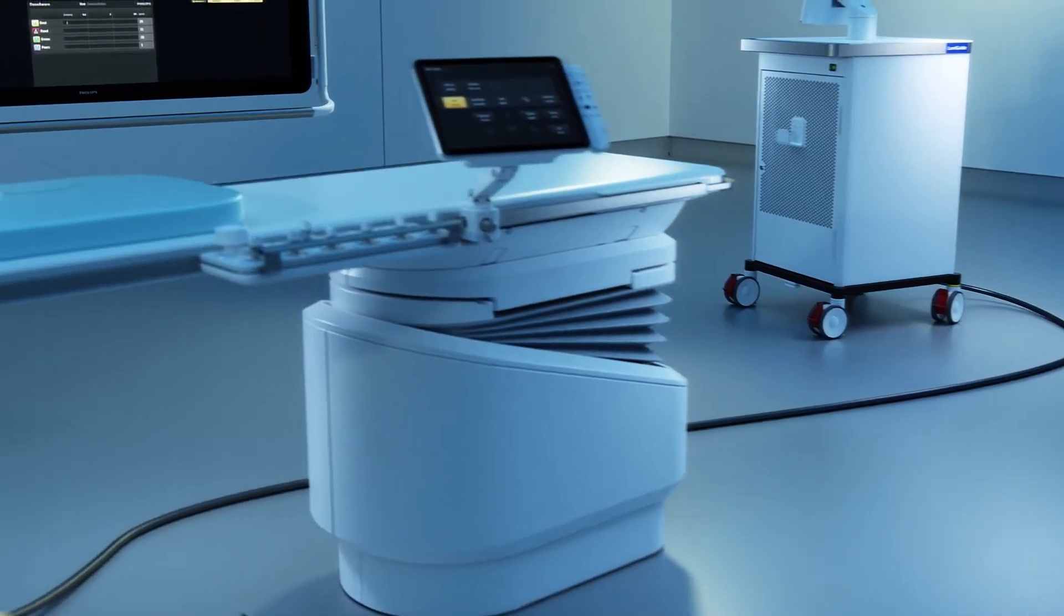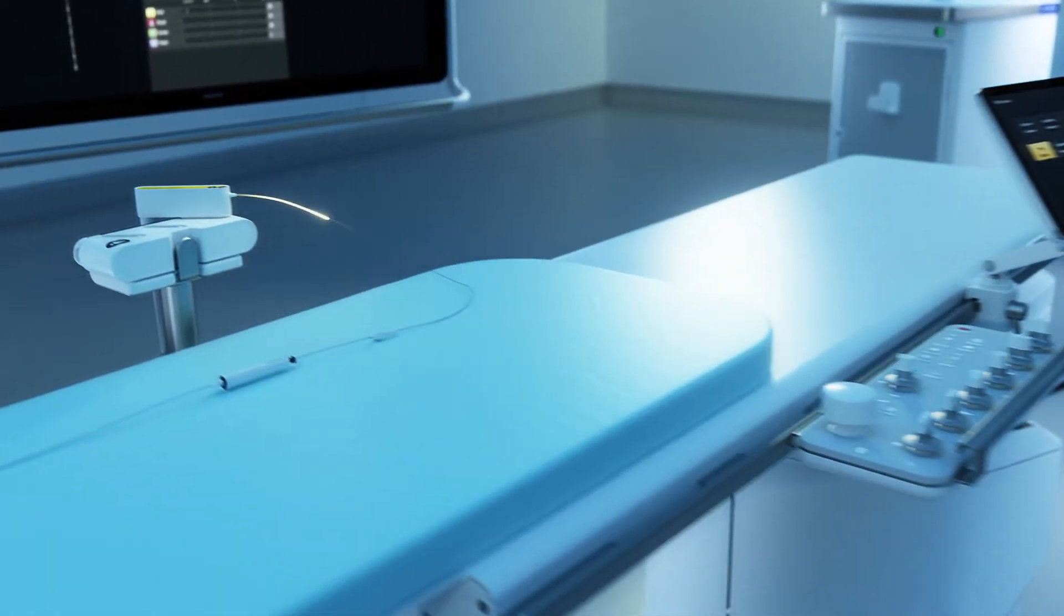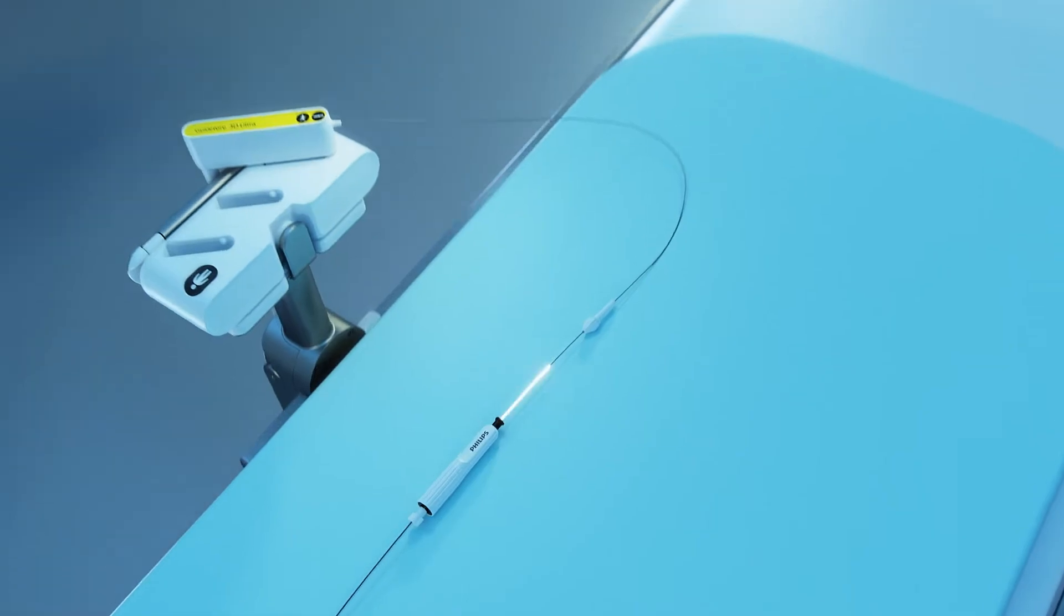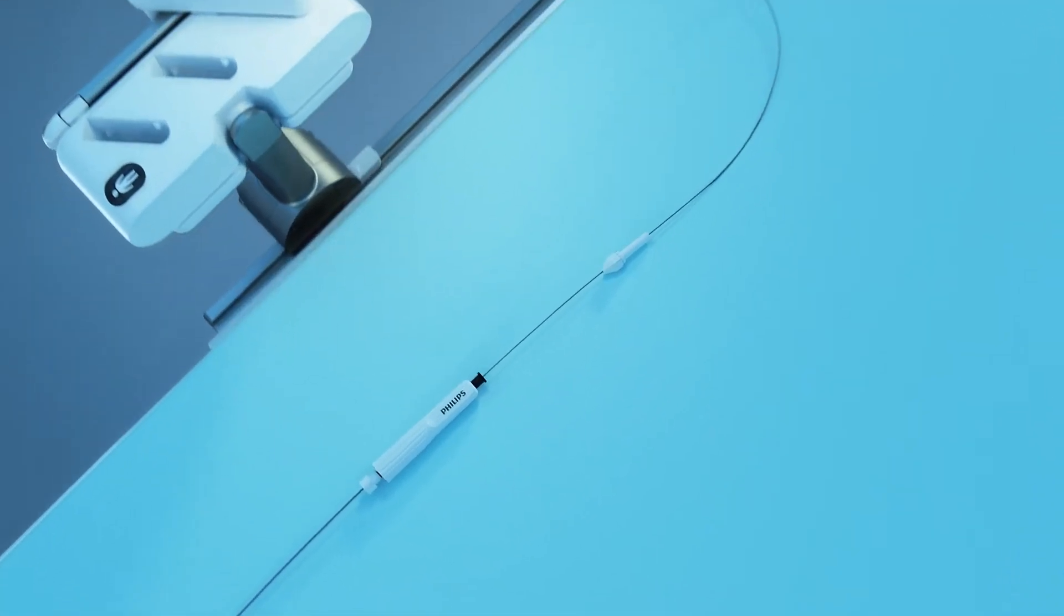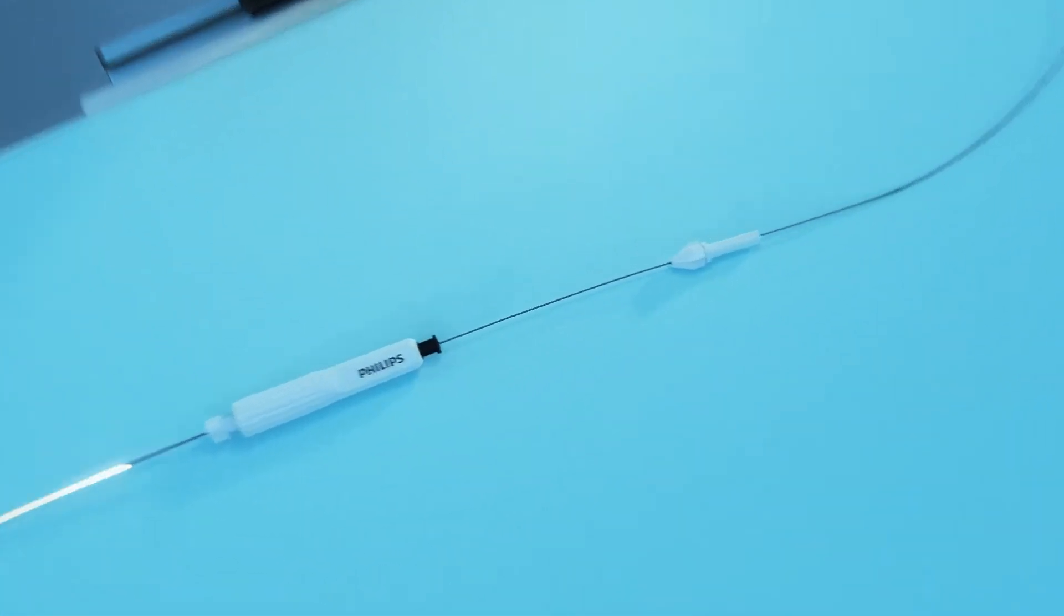This laser light travels to a table-side docking base, then back and forth through a FORCE-enabled guide wire. Let's take a closer look.